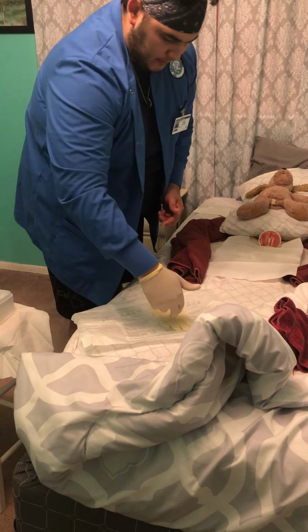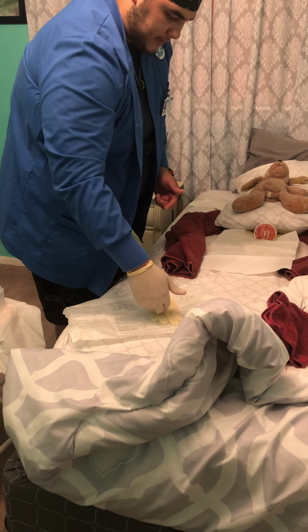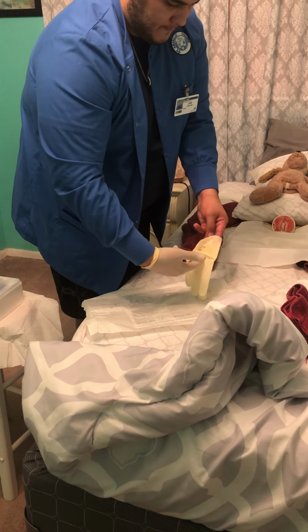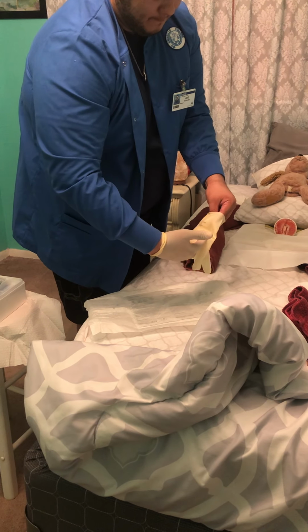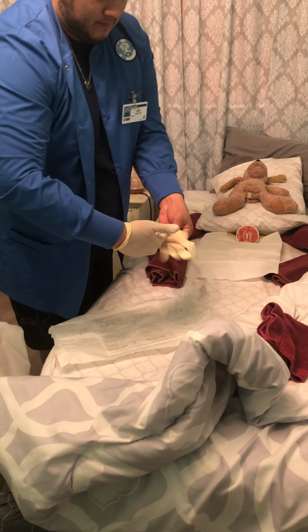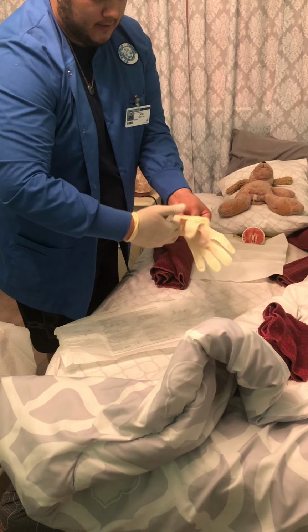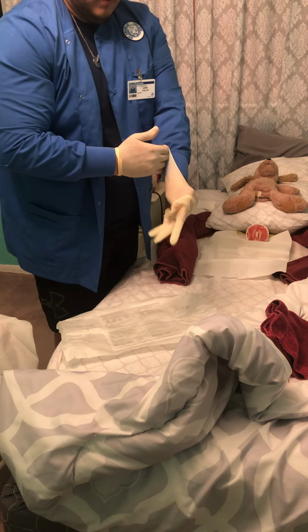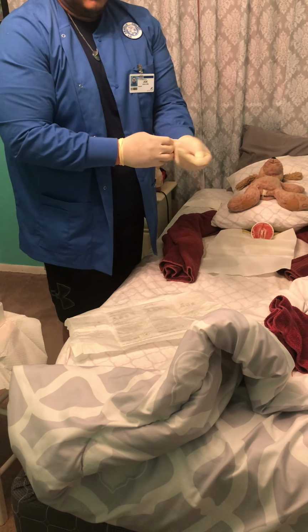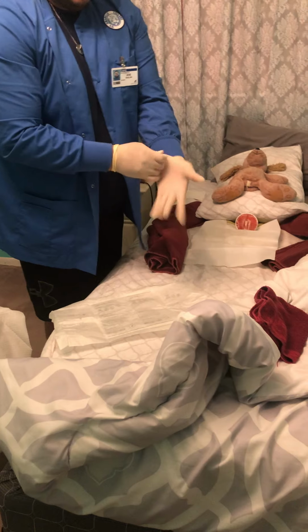And then with 2 fingers, you want to grab over here, because this glove is sterile, you can't touch the inside of the glove. And you kind of just want to pull it over. So once it's on for the most part like that, you can grab it and adjust it.